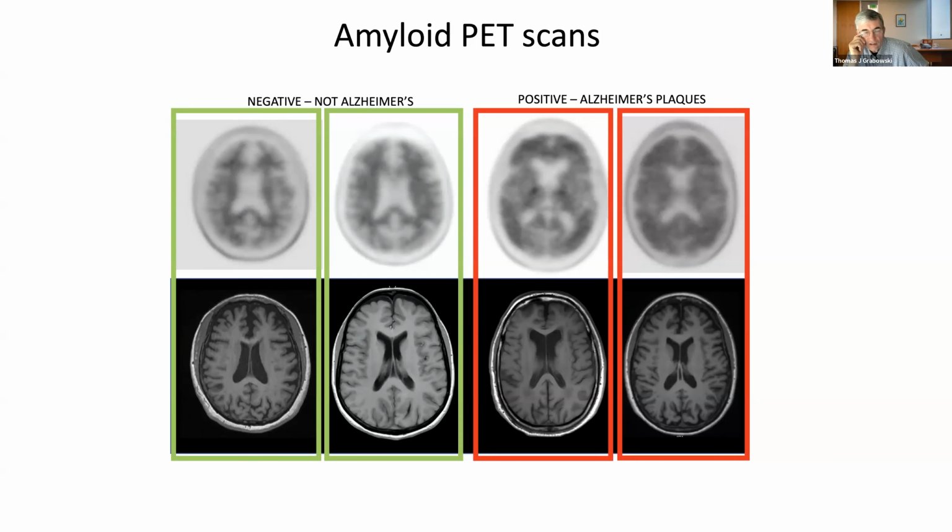What you also need to know is that there's a non-specific uptake of tracer into white matter, and so gray is tracer. You can see that in a normal scan, you can see the white matter skeleton there. You can see the white matter core and the callosal fibers and so forth, and then you have interspersed fingers where the gray matter regions are. If you look at an abnormal scan here on the right, you can see that gray-white distinction is obliterated, right? And you see this ground glass appearance where you can't really see the gray-white contrast. That's what defines a positive amyloid PET scan.